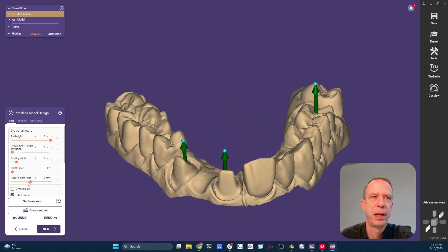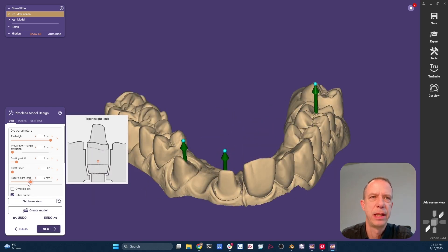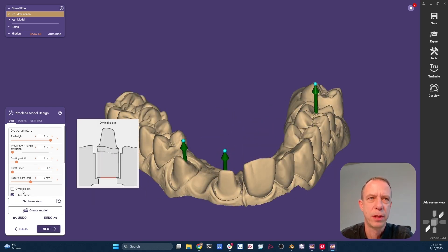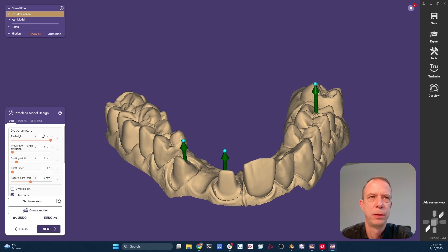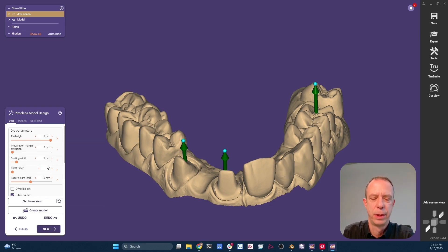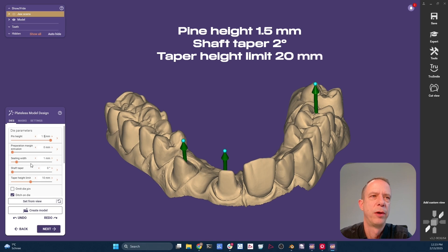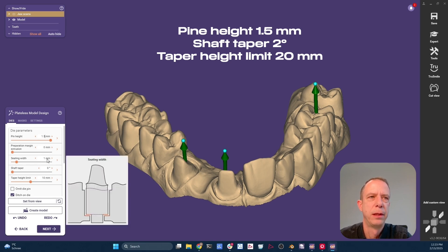We have some die parameters that we have to enter manually that will be fixed in future updates of ExoCAD. But right now, you have to enter this manually. We are going to set the pin height to 1.5 millimeters. Seating with this one millimeter is fine.